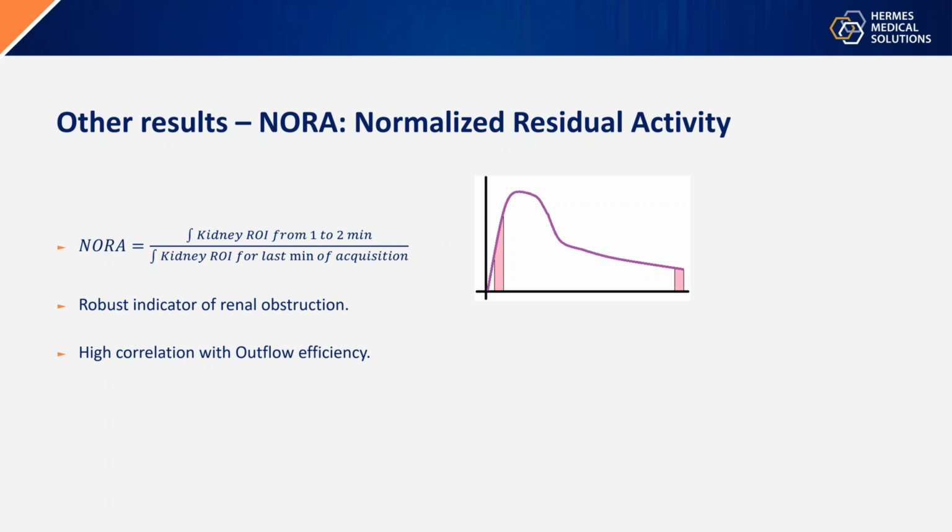In the transit times, I would say there's a risk for it, since you remember we said that the deconvolution technique used to estimate the transit times is very, very noise sensitive. And if you go from a high resolution to an ultra high resolution, you will have a change in noise. So I would guess that yes, for the transit times, it might make a difference. For the Patlak plot itself, I don't think it will make that much of a difference. But I'm guessing a little bit now. Okay, lovely, thank you.